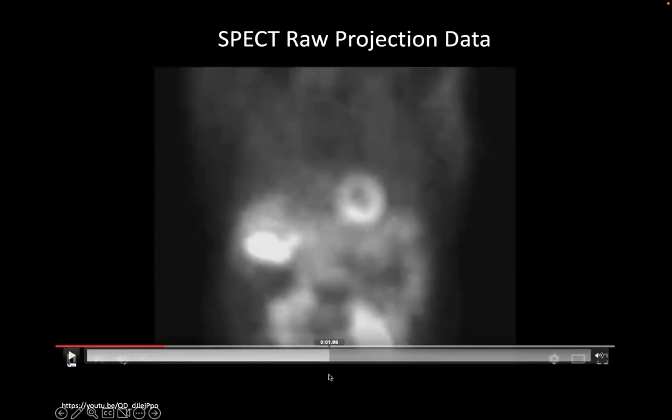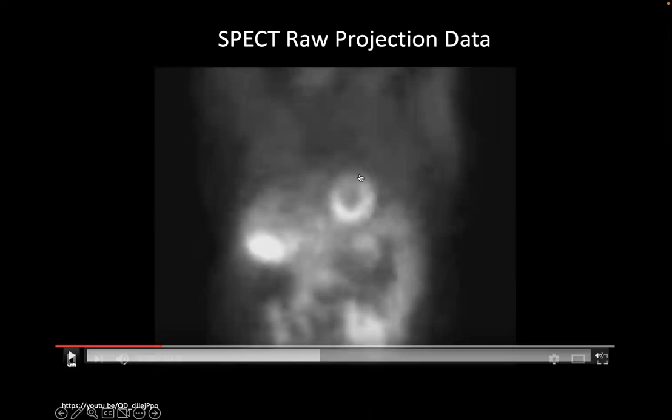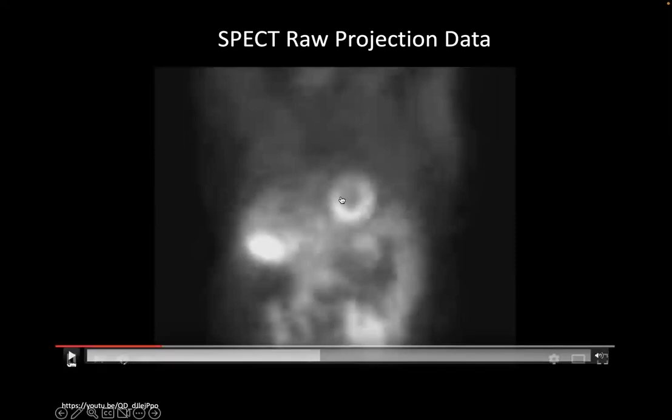When we look at it right down the barrel, this is kind of like a short axis view, but it's obviously dependent on the patient's orientation and the orientation of their heart and their chest. But you can definitely see down the chamber of the left ventricle here. Remember, this is brightness from all of the pieces of tissue that are perpendicular to this plane, integrated through the patient.